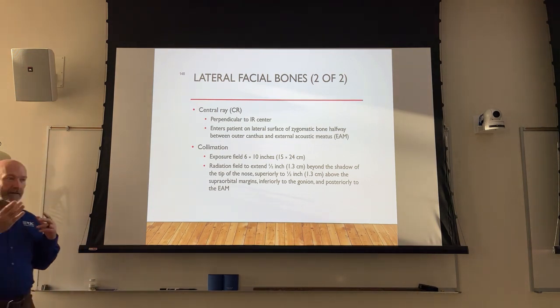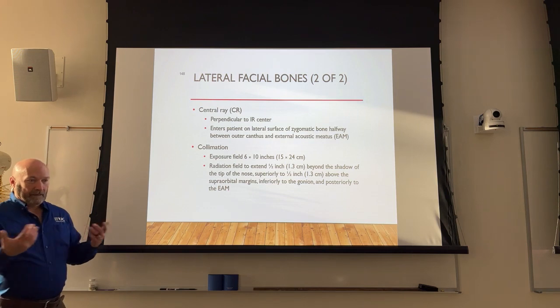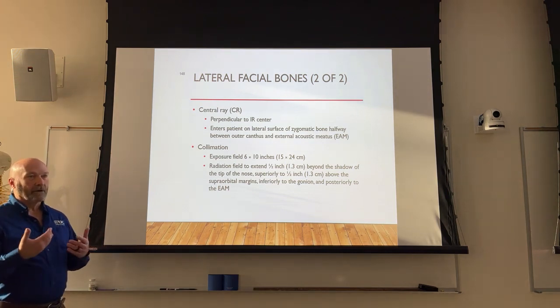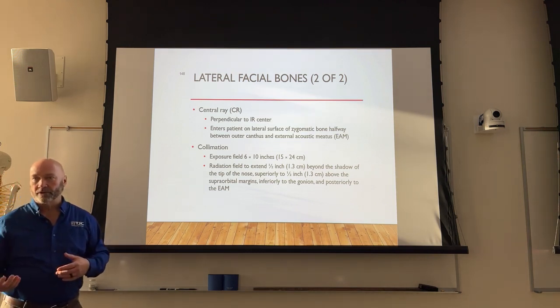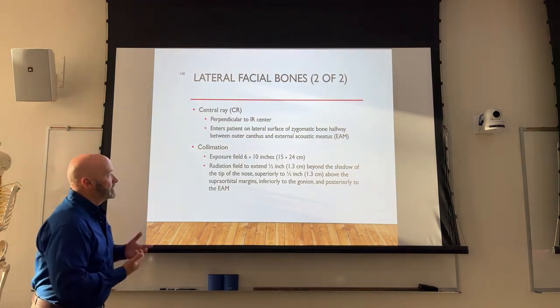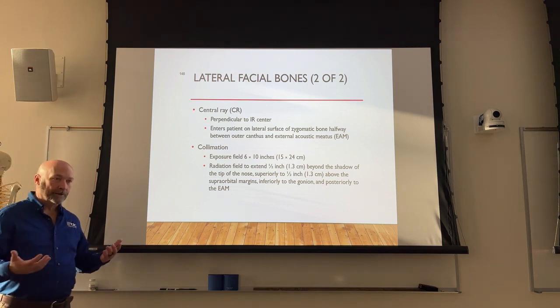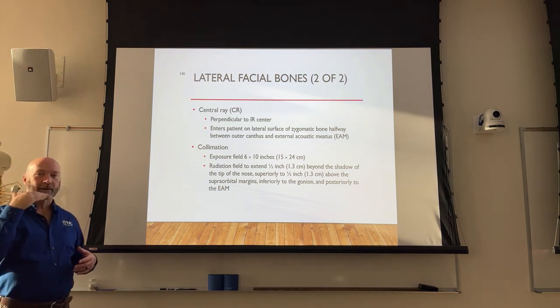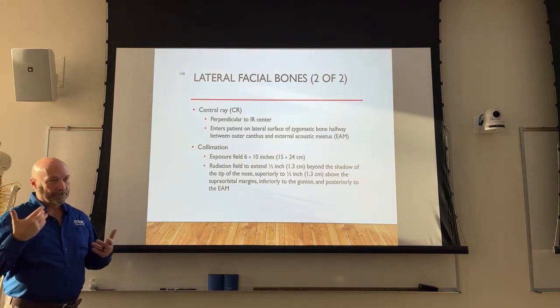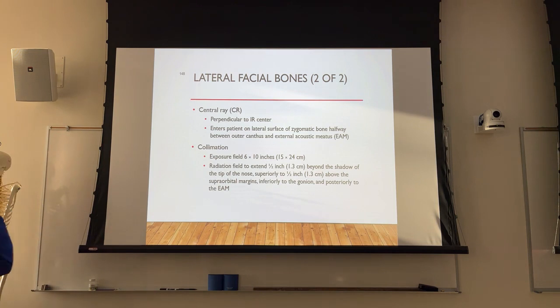Open up your collimation wide enough to include the nasal bones and far back enough that you would include essentially the entire zygomatic arch, because it's a common facial bone fracture. Even though the zygomatic process is really a skull bone, it's still considered a facial bone. So put it where you're going to see all the facial bones. Don't open up your collimation to include the entire skull, just from about midway up the forehead down to about the teeth, and then open up your collimation to include everything front to back, okay? So collimate everything else off.